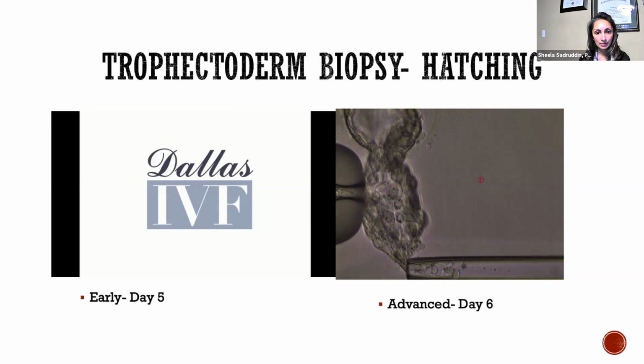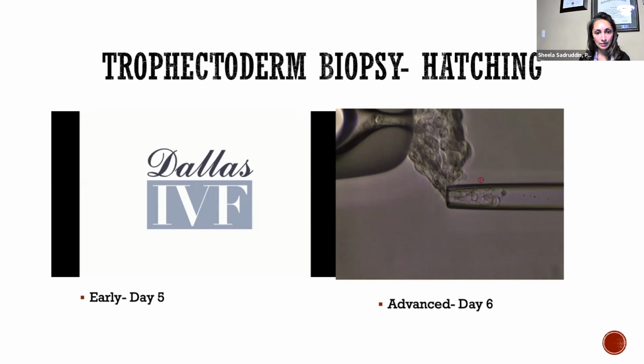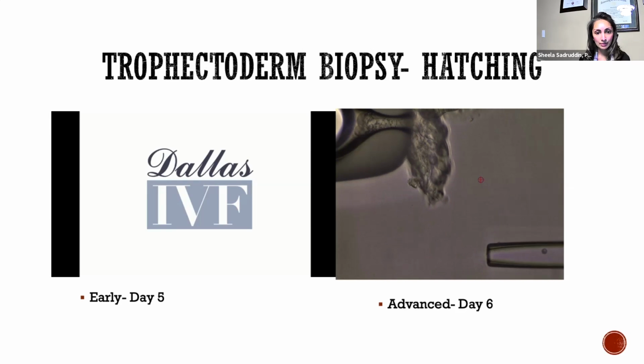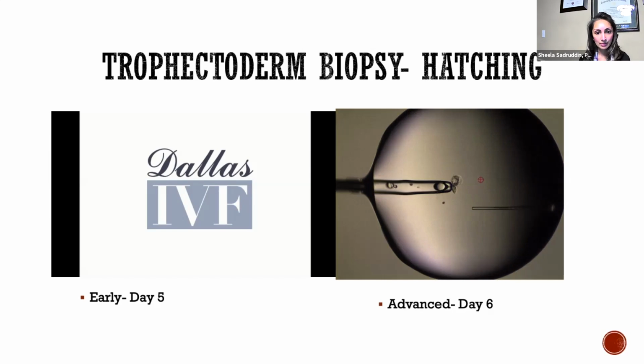Continuously throughout the entire procedure, applying laser pulses is that we reposition our embryo herniated out of the zona pellucida, and that allows us to then stretch the biopsy where we can easily just break it off. So just know the differences between the day 5 and the day 6 embryo, and know that you're not going to always have the same approach when you're biopsying the various stages, even though both of them were hatched. Next slide.